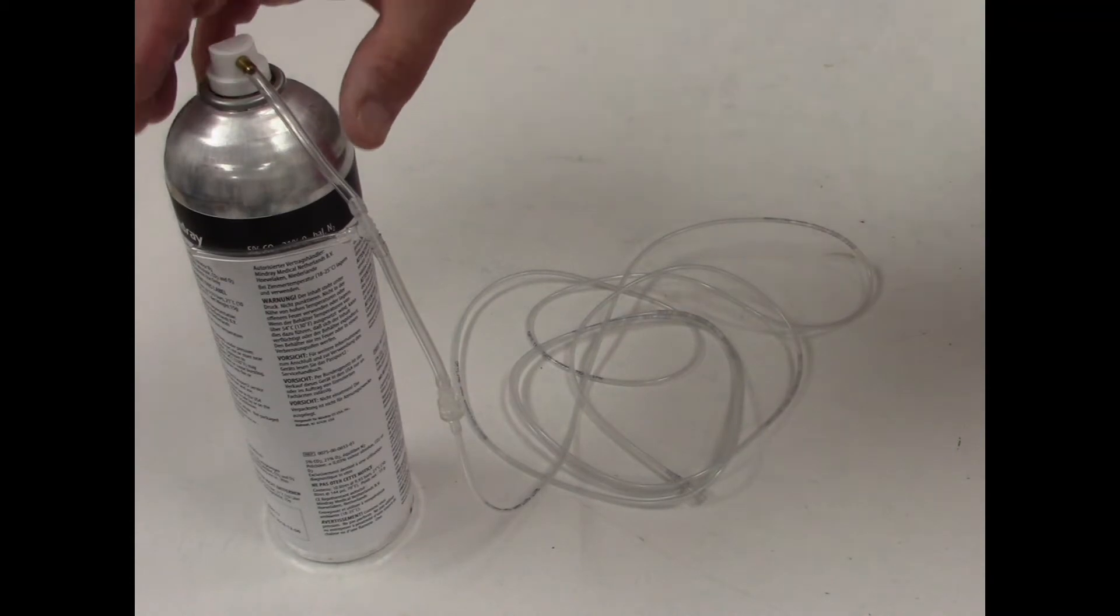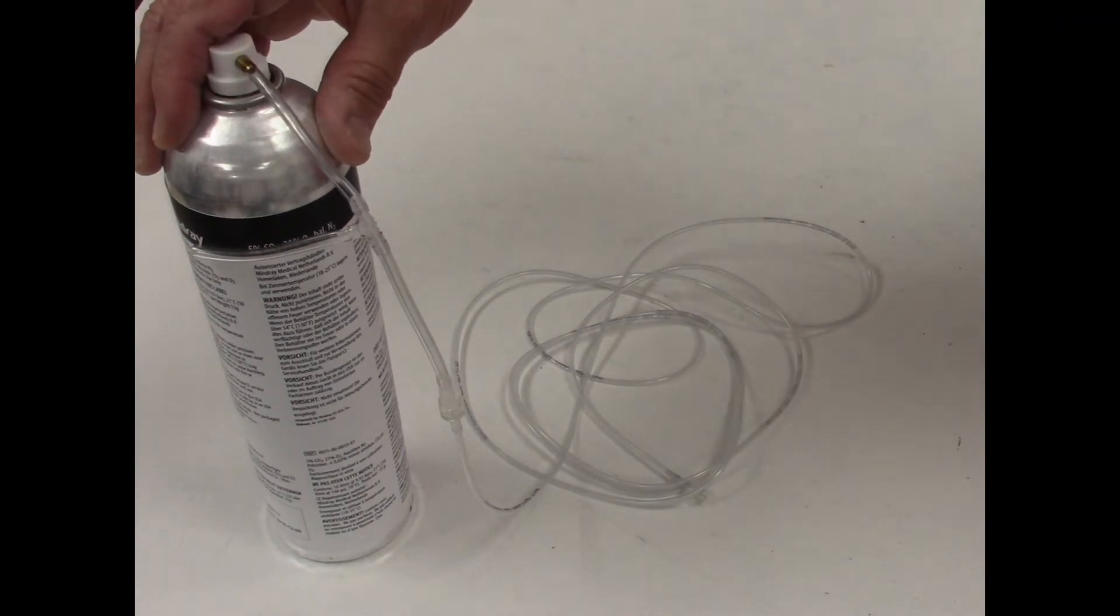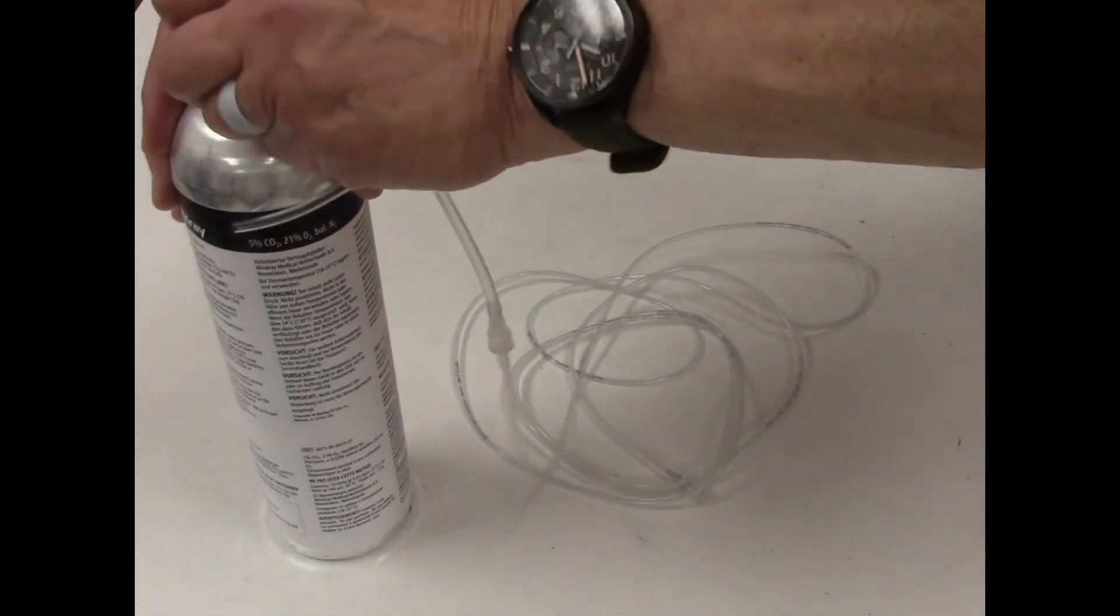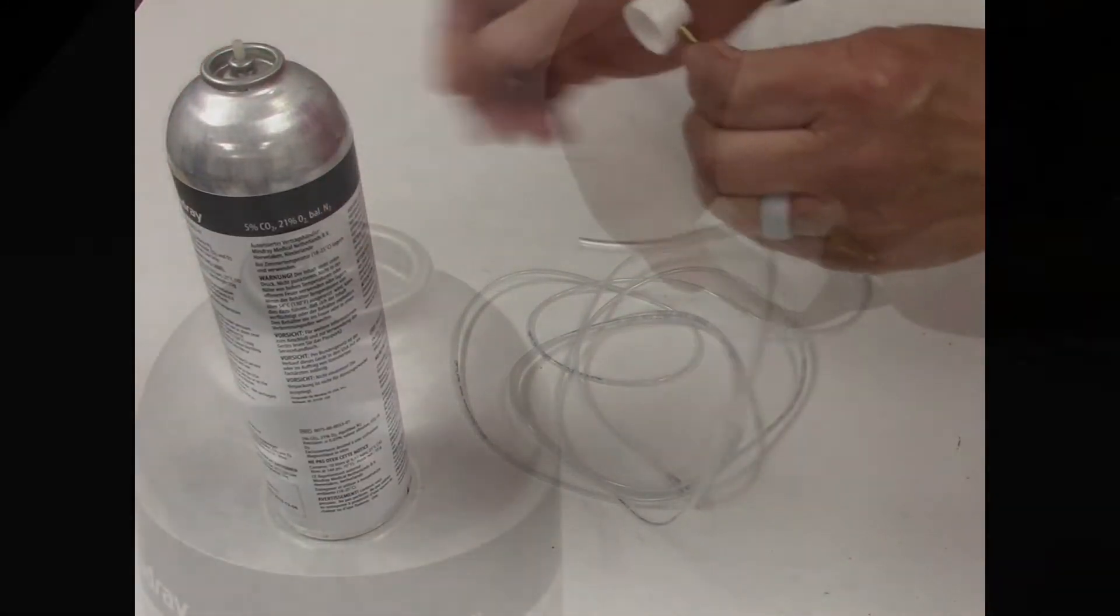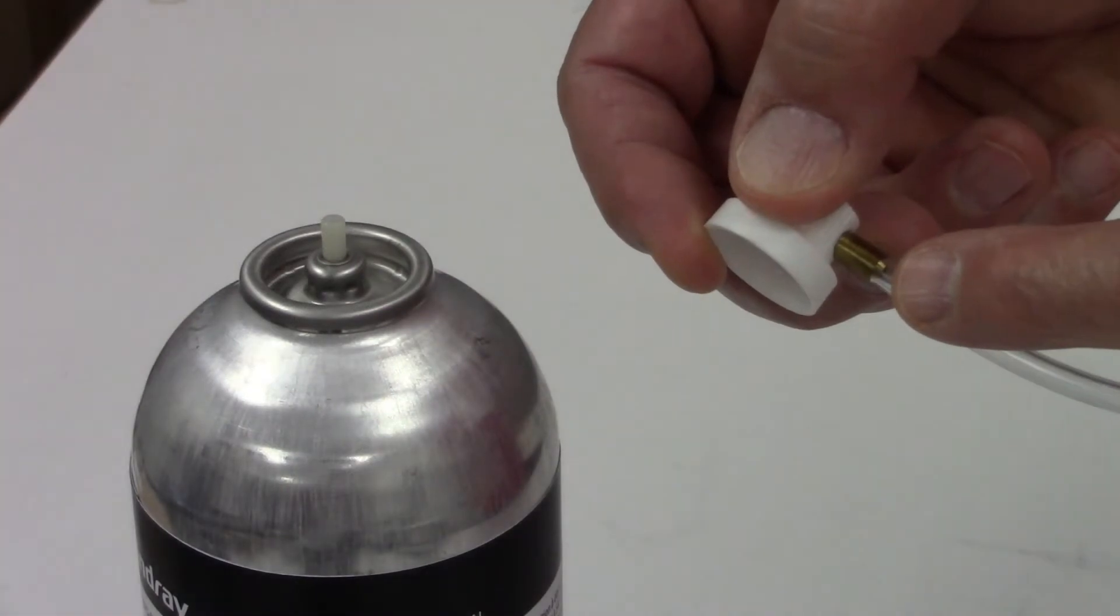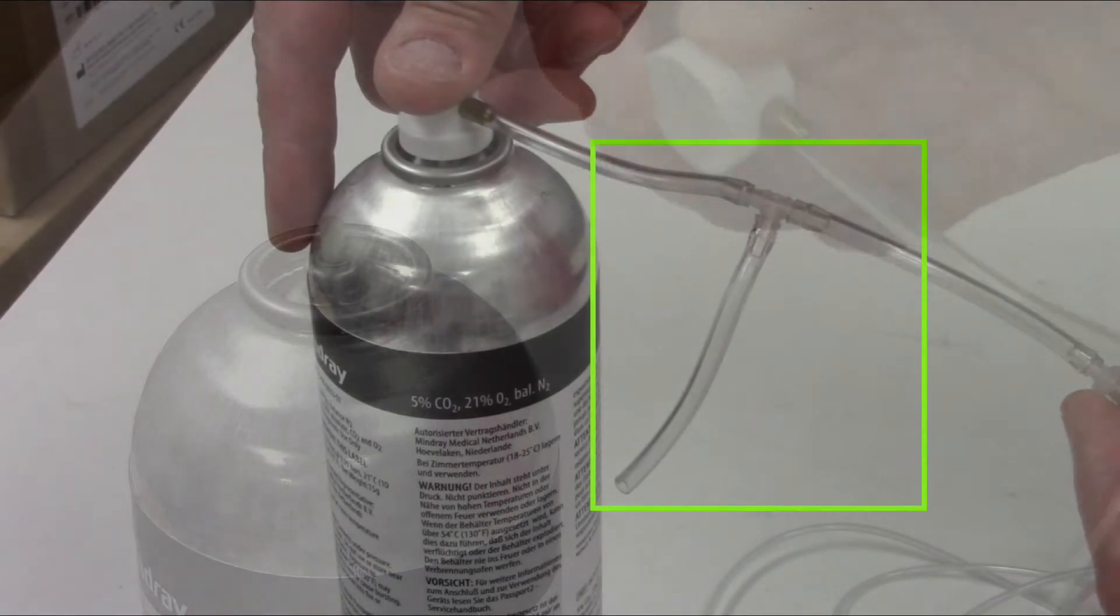This is Mindray's CO2 calibration gas. When you order and receive it, it will include the CO2 gas cylinder, a push-button delivery with a flow restrictor built in, and a vented T-fitting.